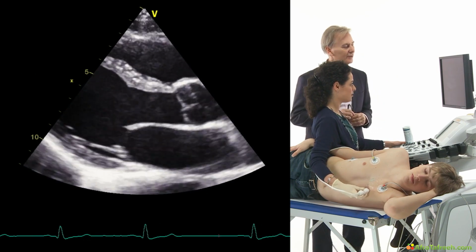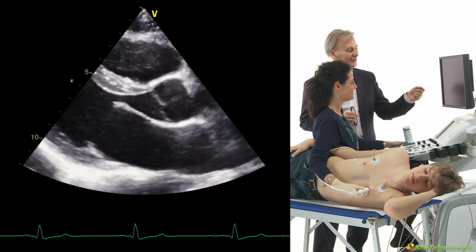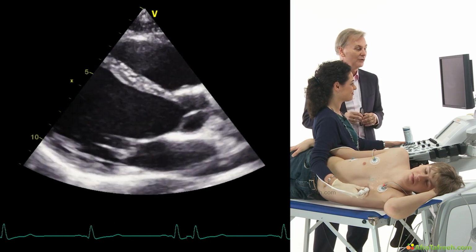Yes, it's an absolutely normal valve. After all, this is my son here, and I hope he is normal. But you can see that the leaflets are not thickened. You can see that the opening and closing motion is completely normal.